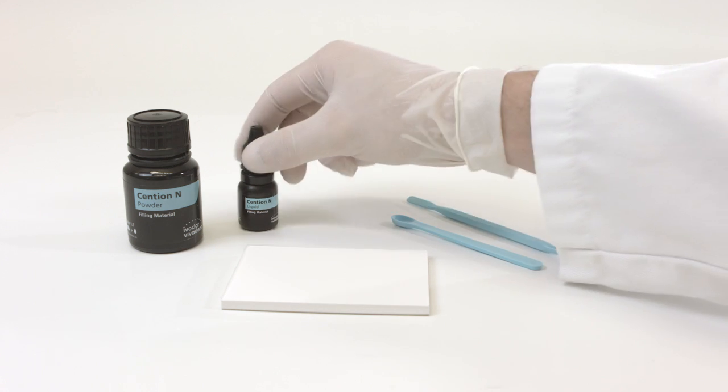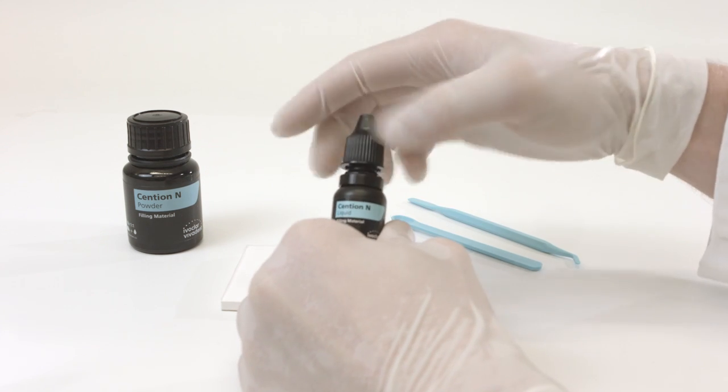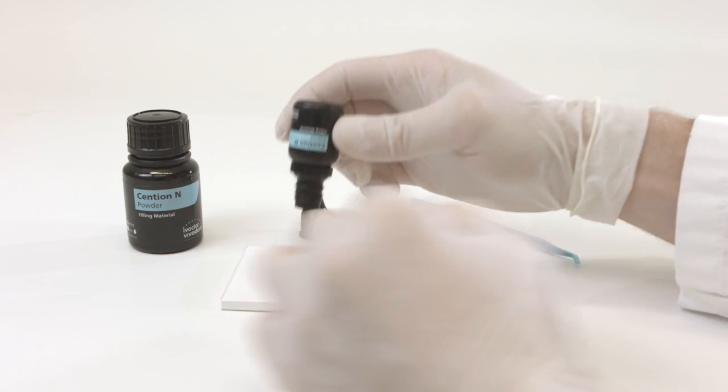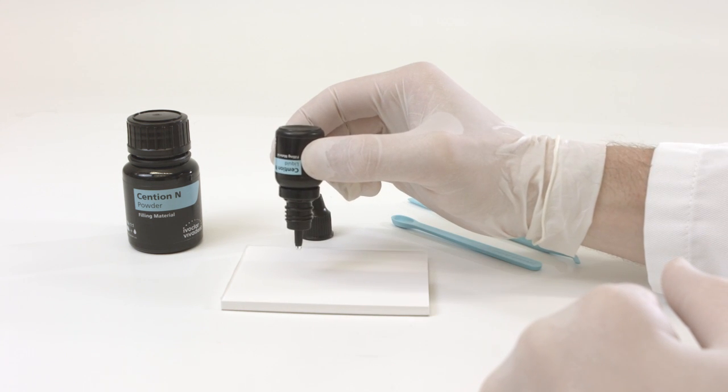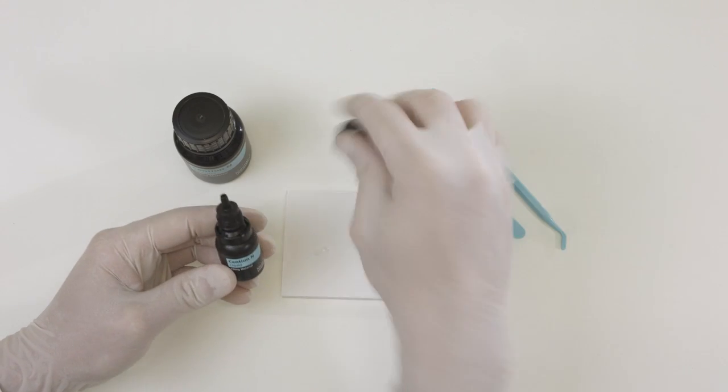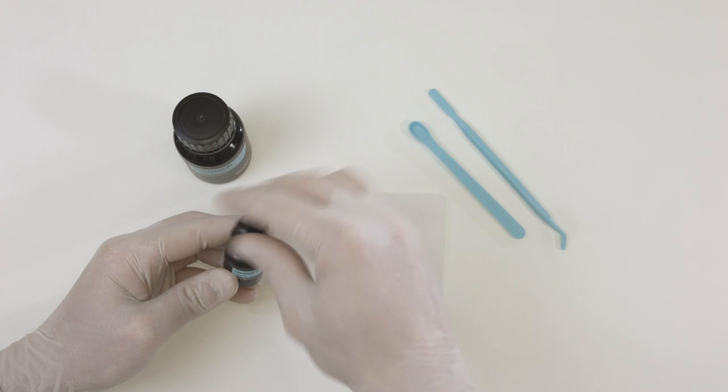Hold the bottle containing the liquid in a vertical position. Squeeze the bottle lightly and evenly to dispense one drop. Make sure that the drop separates from the bottle by itself without touching the mixing pad. This helps you prevent air bubbles from becoming enclosed in the liquid.